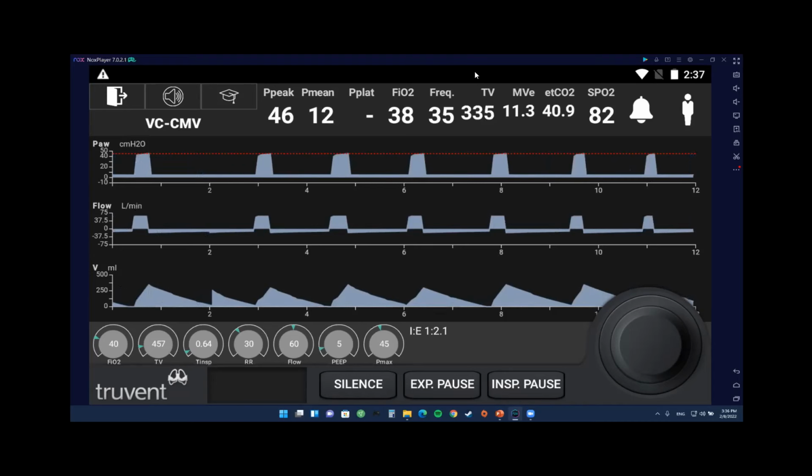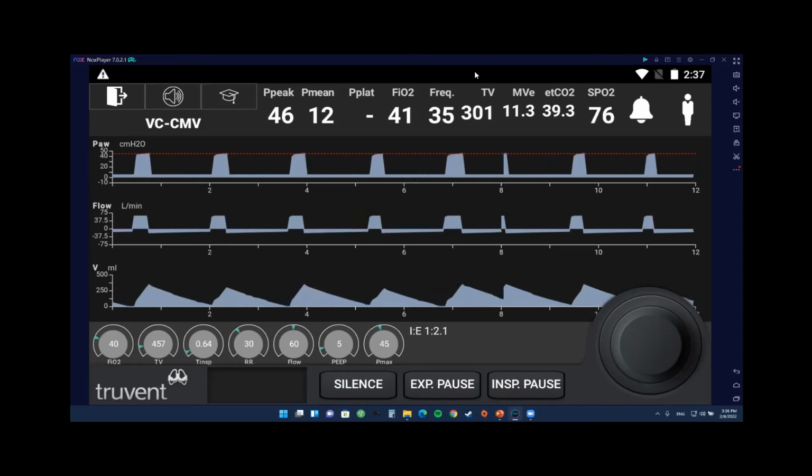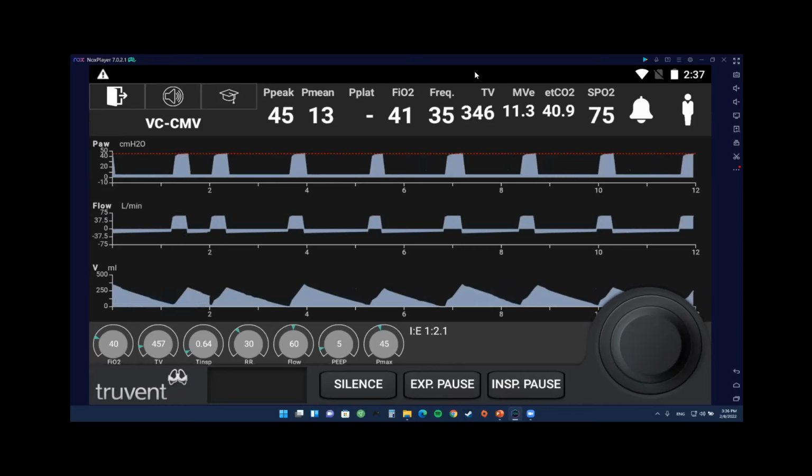You have your patient in front of you. What do you want to do with the patient? The patient is desaturating, the oxygen is dropping. Now the patient is 75. Where do you want to start your search for an obstruction? Start by suctioning the tube. Make sure he's not biting anything.